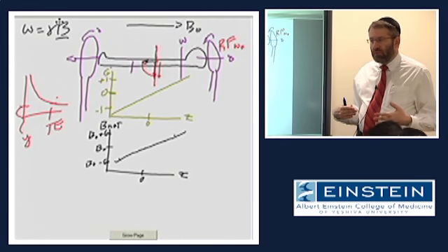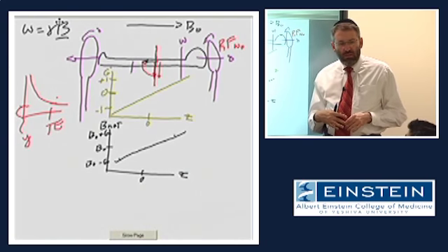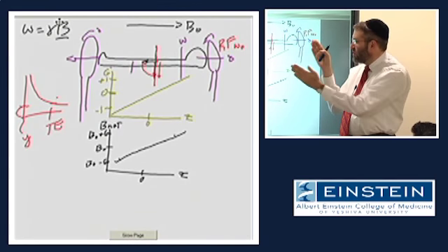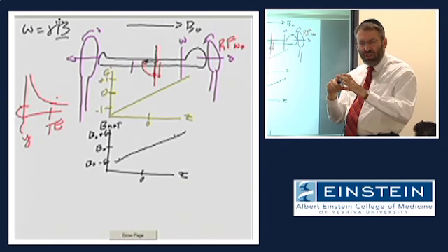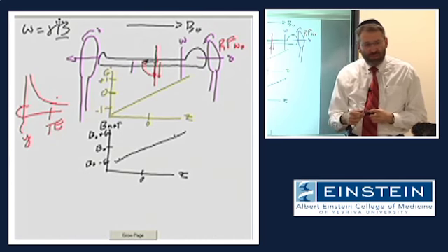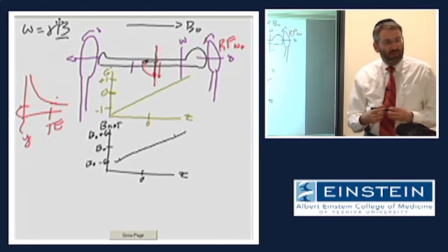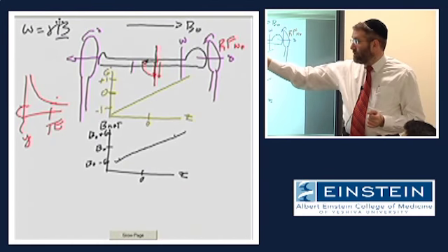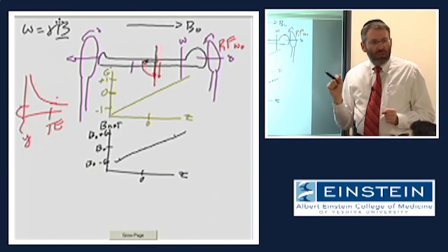So how could we do that? We do it all the time. Turn the patient on their side. Okay, well, to do coronal imaging, you would have to actually turn the patient so they were transverse to the bore of the scanner, which is why you can't really do that kind of direct coronal scanning in CT, and you rely on reformatting the images. Right? In what way? Well, this gradient magnetic field can only create a linear gradient in this direction. So you can't change this gradient magnetic field.